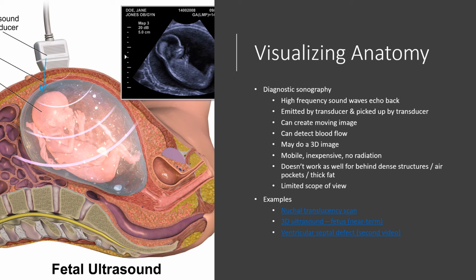Because it waits for stuff to bounce back, it's good at detecting where solid things are, of any kind. It's sending these signals and picking them back up in real time so you can see movement. It's really popularly done in pregnancies to look at the fetus, because sound waves don't hurt anything. It's not radiation, right? So as this is sending signals and getting them back, if the baby moves his arm, I say he, it's not always a he, of course, but I have two sons, so I default to he. You can pick up that change really quickly and see it all reflected on the screen. It's great for creating moving images.